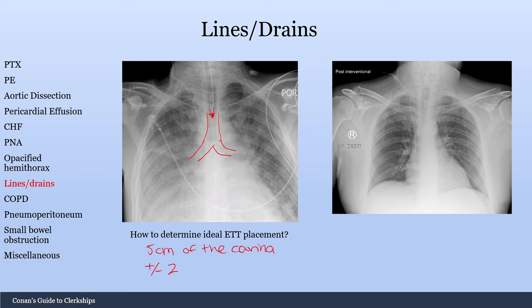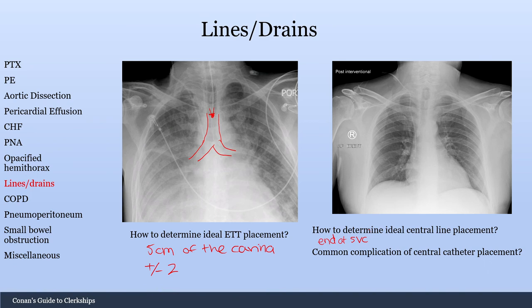Here we have a central line going in from the right internal jugular vein, terminating right here. How do you determine ideal central line placement? For this IJ, it should terminate in the superior vena cava. A common complication of central catheter placement, especially IJV lines, is pneumothorax — because you're cutting in up here where the lung apex is, which could accidentally get punctured.